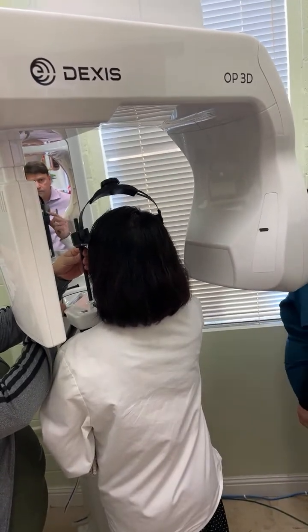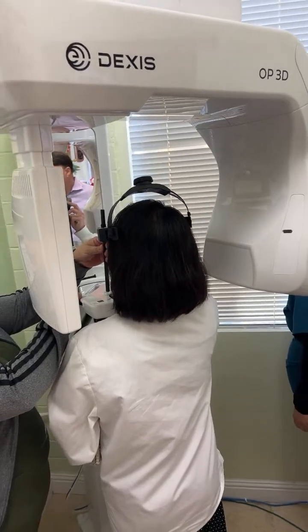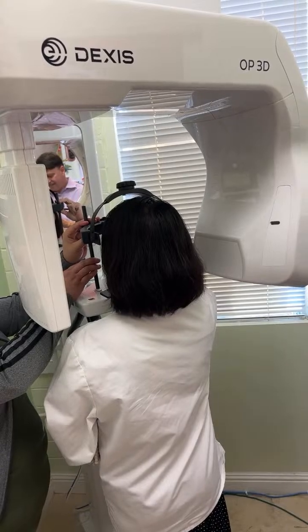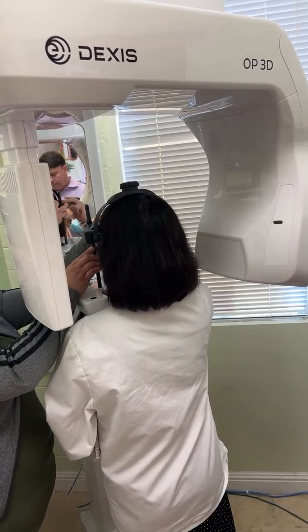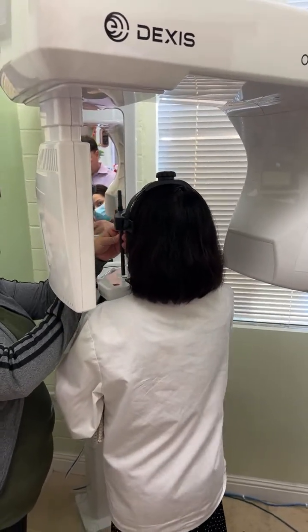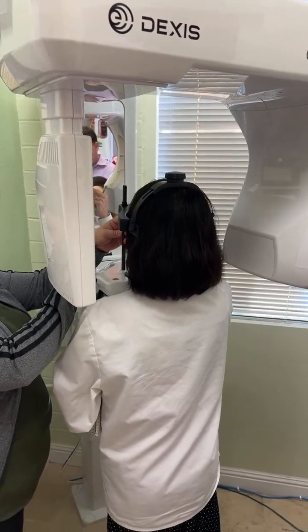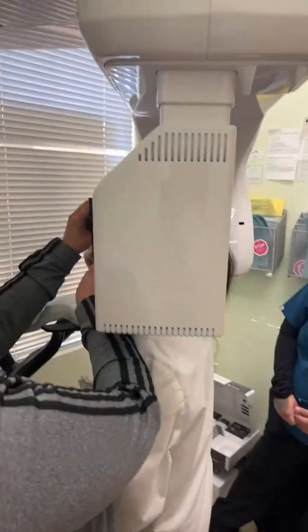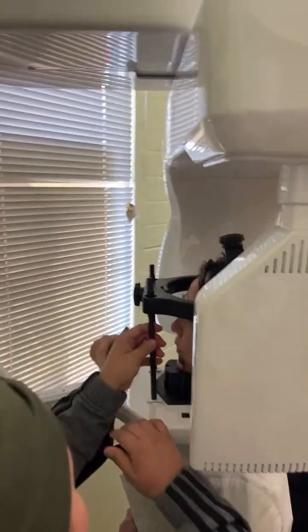First, move this one first. Move this one down. Make sure it's parallel, right line, yeah, and then pull that. As long as it's in your eyes. It's supposed to be in your low forehead, right? Yeah, it has to be in your forehead.